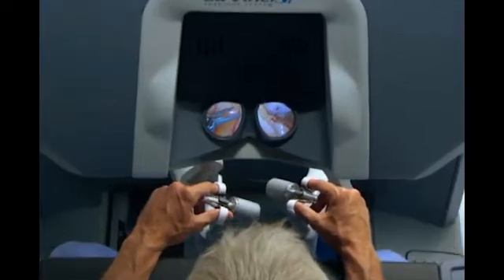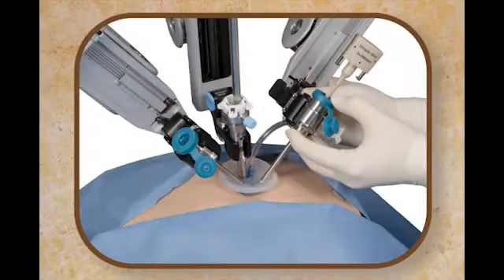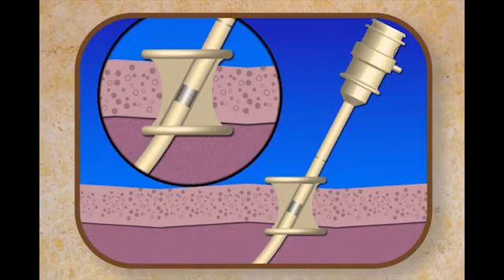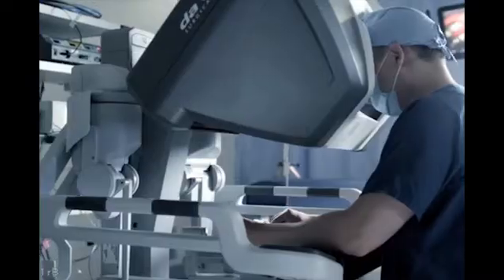An advantage of the Da Vinci robot are that we have improved visualization of the operative field and a three-dimensional view of the surgical area in which we're working. It also allows us to magnify and zoom into the area, and has high definition visualization of the operative field. The Da Vinci robot allows us to work within a very confined space in a precise and effective manner. The robot performs only the movements and instructions that the surgeon instructs it to do, and allows for very precise and effective movement within a confined operative field.